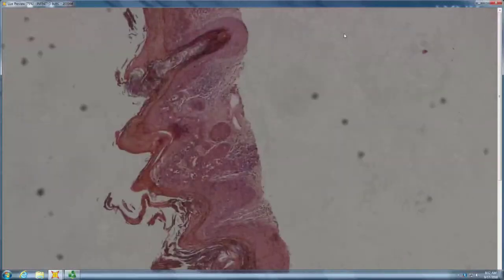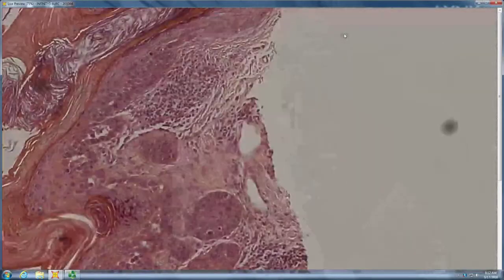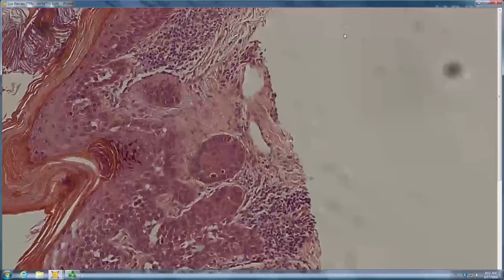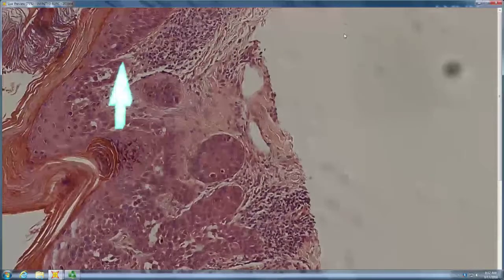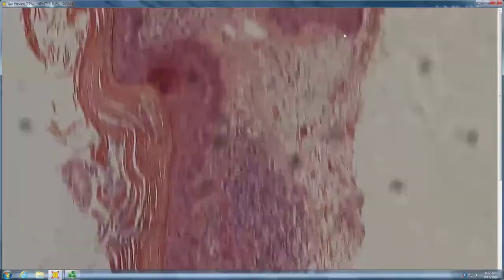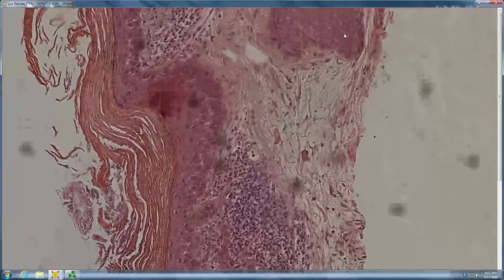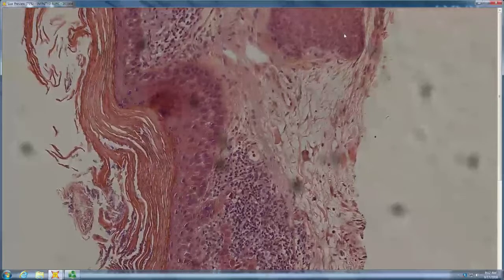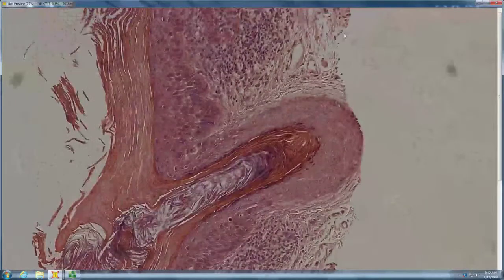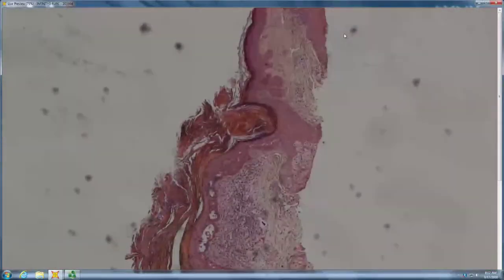There's hyperkeratosis. Acantholysis in there. Just acantholysis. No, there's some dyskeratosis too. And are the cells normal or abnormal? They're abnormal. Yeah, kind of large, atypical cells, budding downward, acantholytic. Like a squamous cell carcinoma. Yeah, or one step short of a squamous cell carcinoma. Just acantholytic AK.